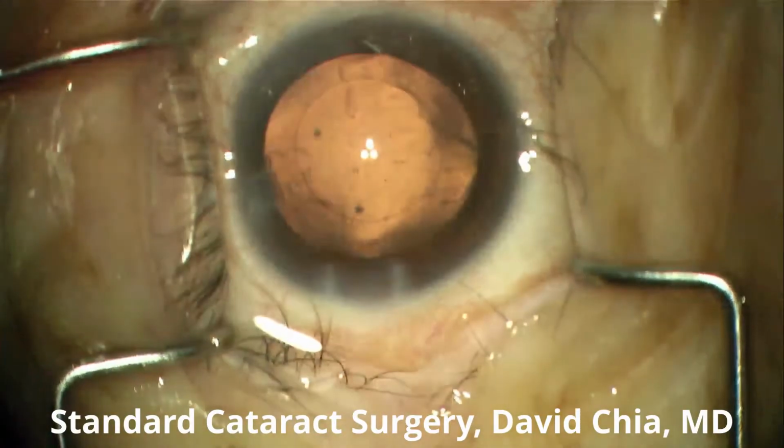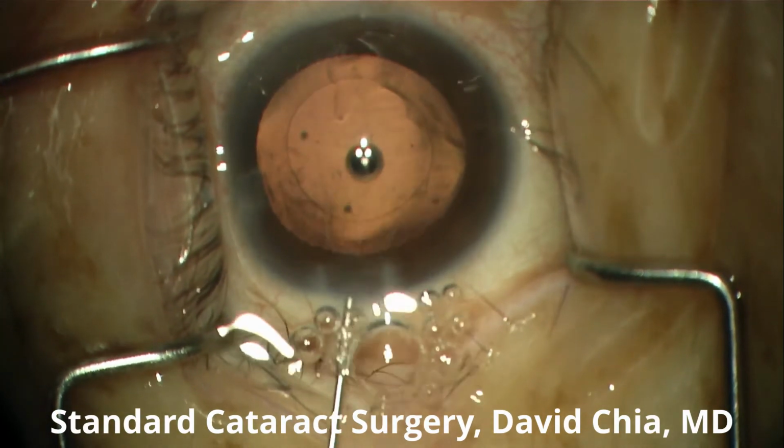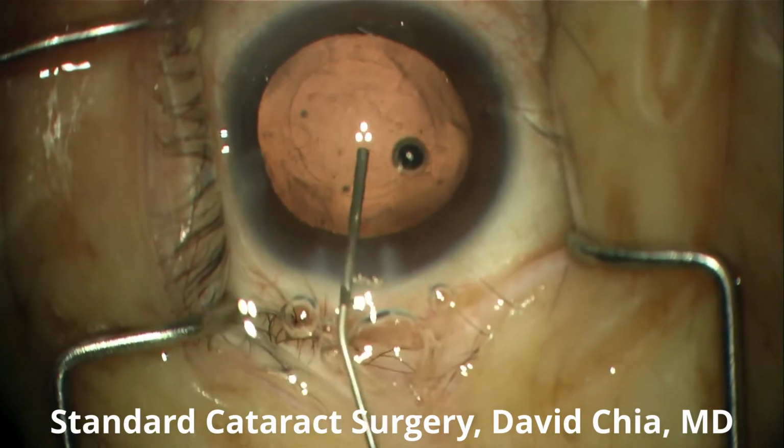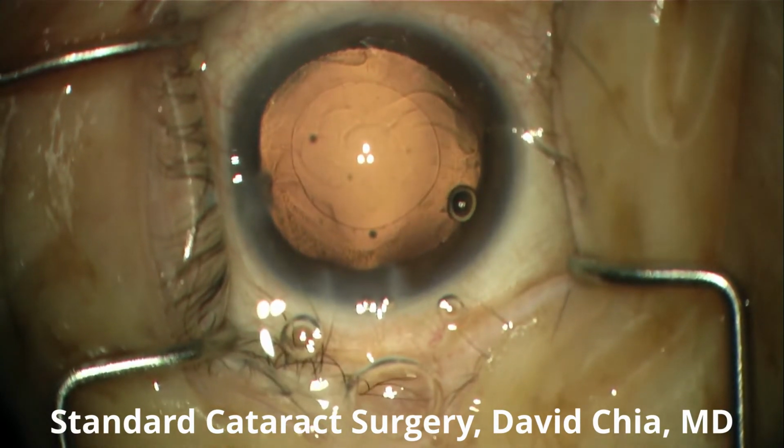We've turned off the microscope light, and here we're inserting some additional viscoelastic to inflate the capsular bag and prepare for the lens insertion. I have edited out the preparation of the intraocular lens.